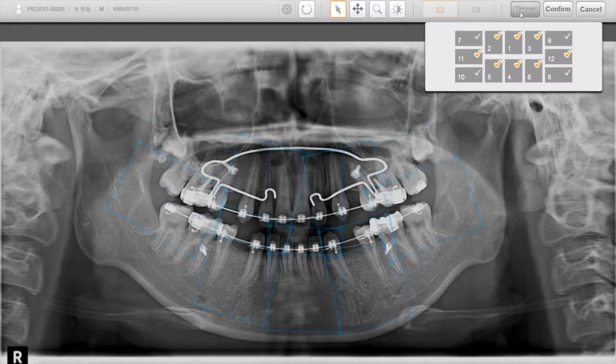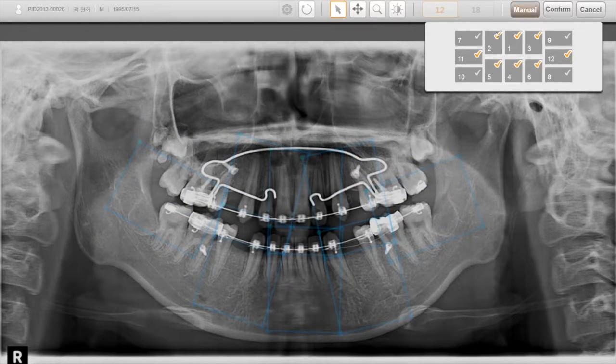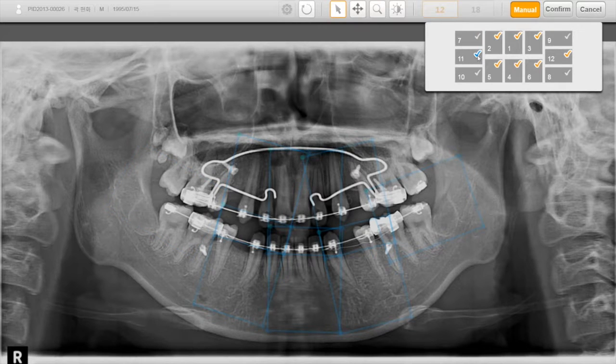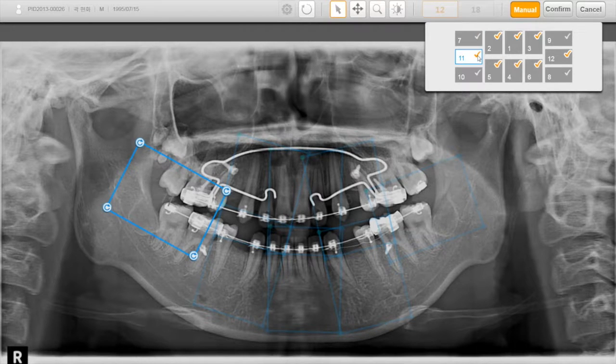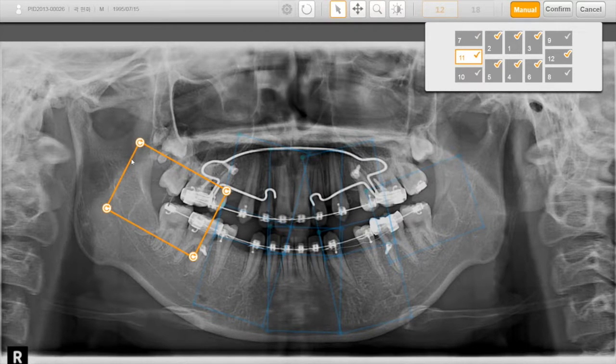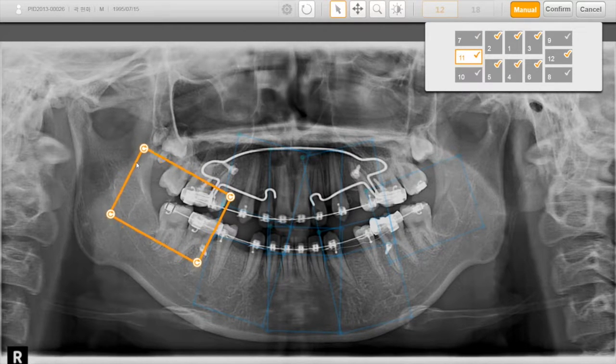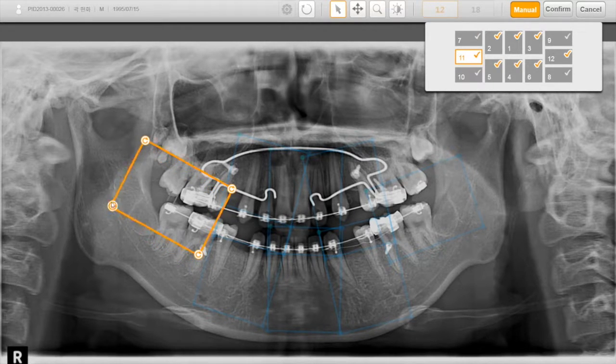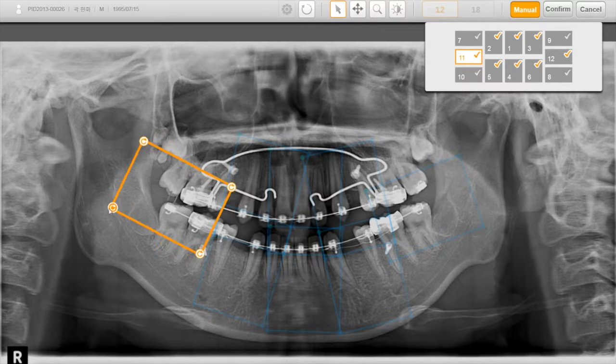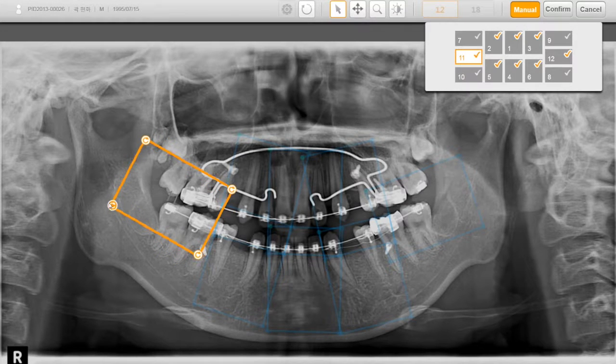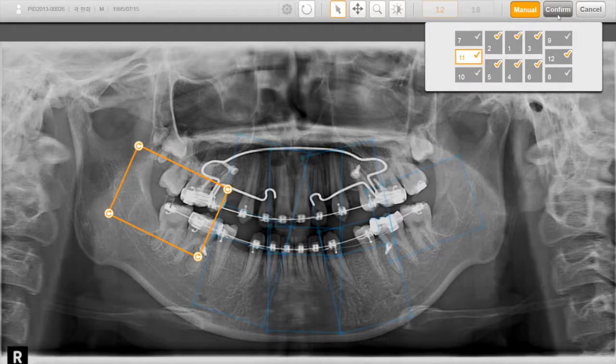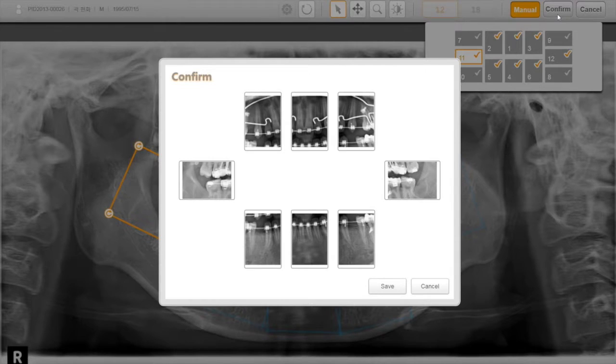Manual button allows the user to customize numbers of images, position, and tilting. Click on Confirm to save the manipulations.